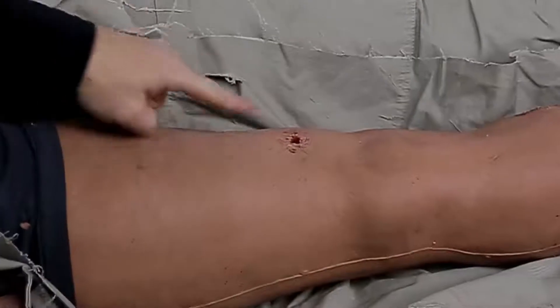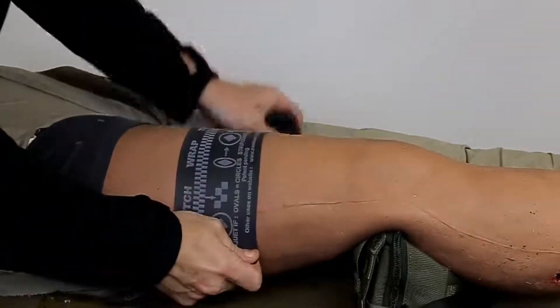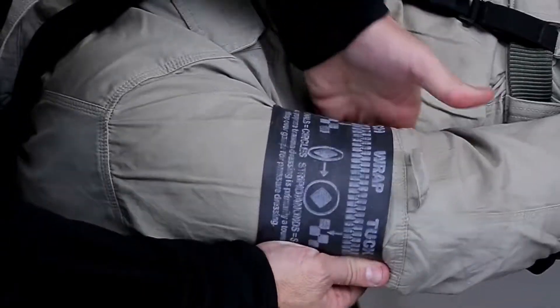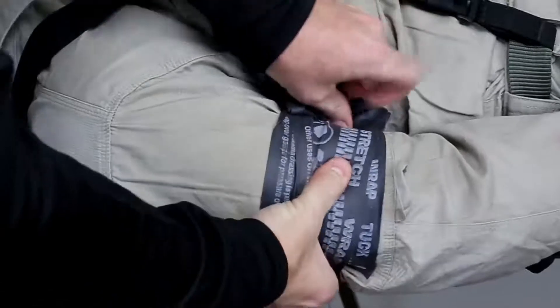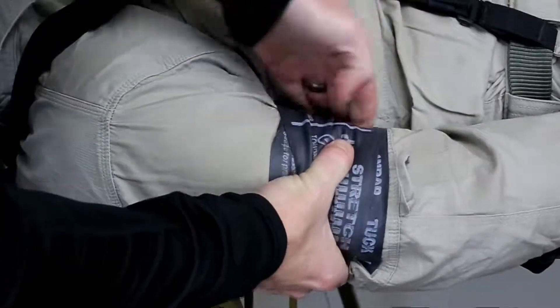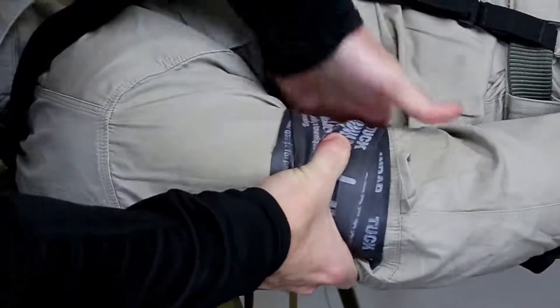Placement. Ideally, you want to expose the limb and visually identify the source of bleeding in order to place the SWAT-T between the wound and the body. In some circumstances, visual identification of the wound location may not be practical; in those instances, the SWAT-T should be placed as high on the limb as possible. Be aware that a patient may have multiple wounds, and careful monitoring should be continued after tourniquet application to ensure all bleeding is controlled. Always double-check the tourniquet application after you move a patient.